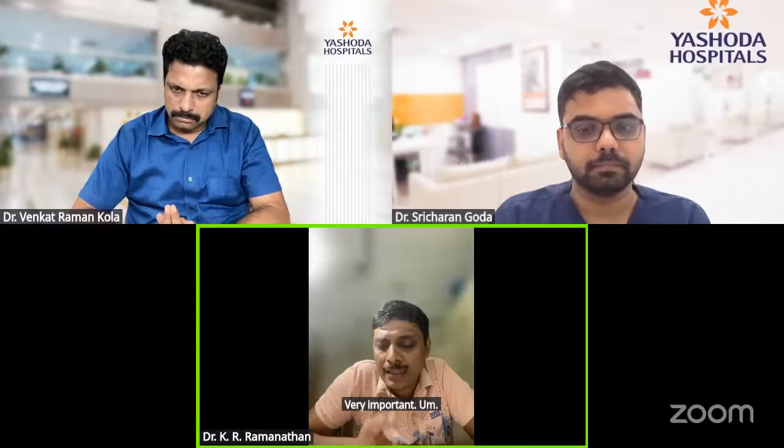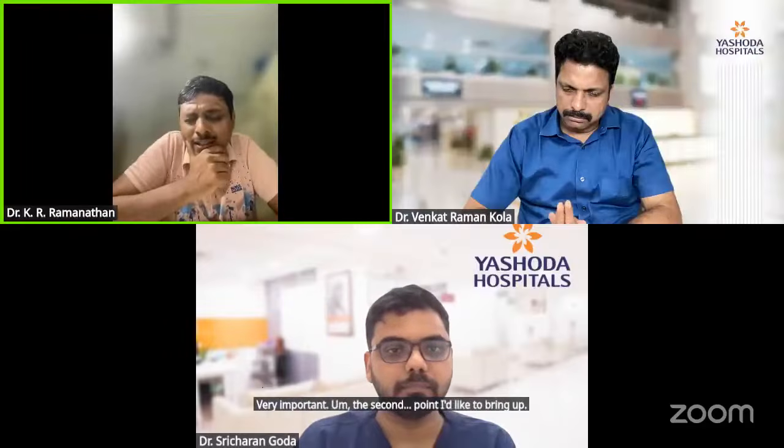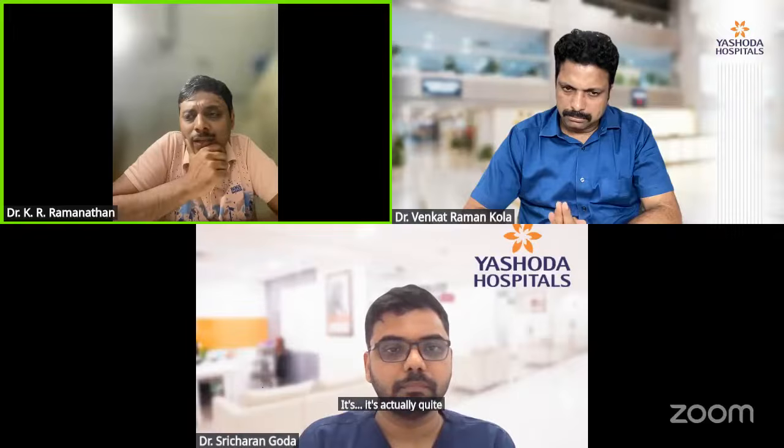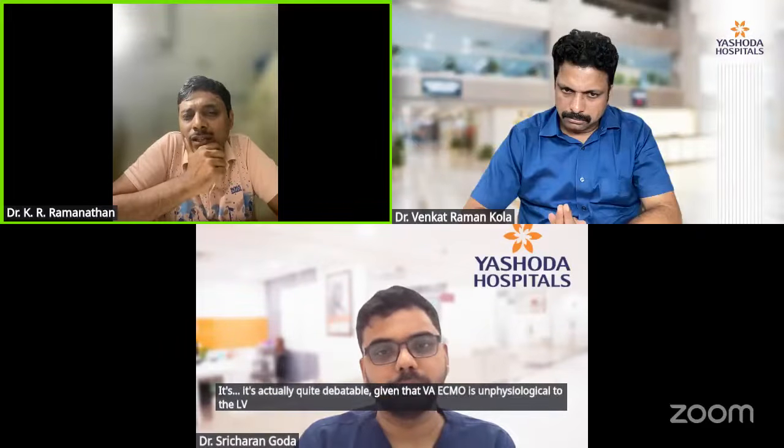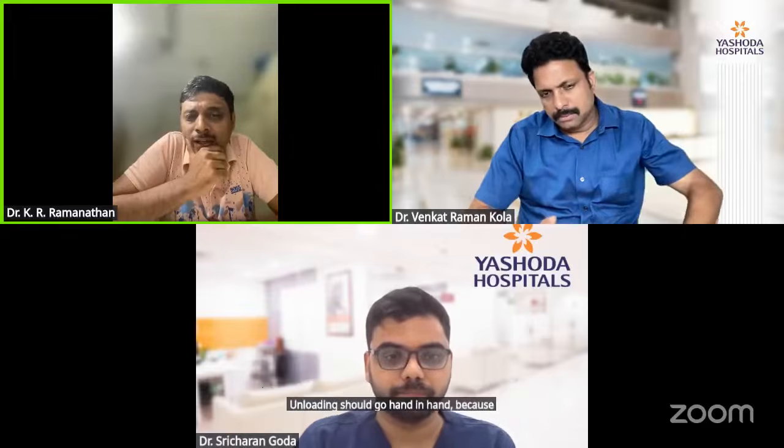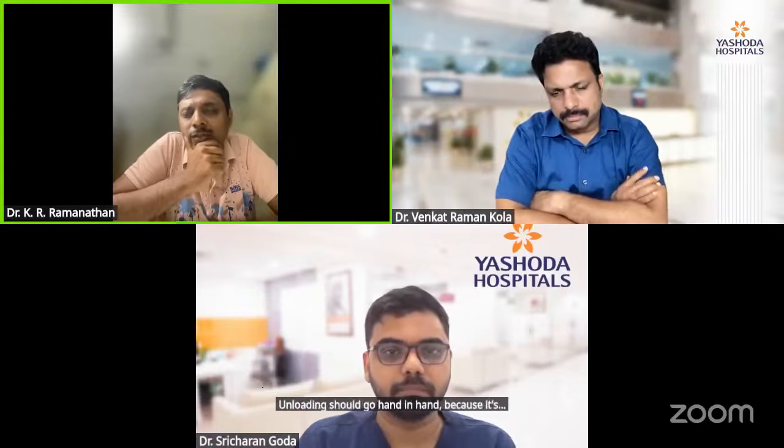The second point I'd like to bring up is actually quite debatable. Given that VA ECMO is unphysiological to the LV, should unloading go hand in hand? There are observational studies to say that unloading helps, and clearly unloading aids myocardial recovery.